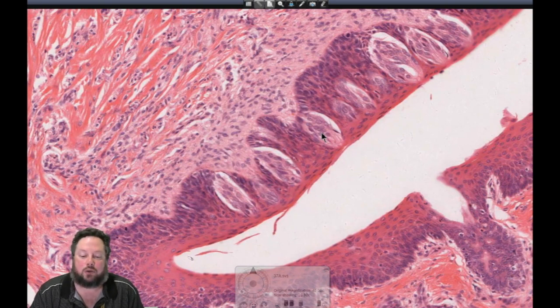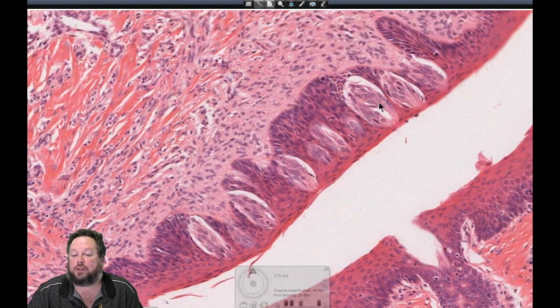Salty. One's tasting salty. And I think I mentioned in the lecture to the second year medical students, and for those of you who weren't there, there's a proposed 6th taste modality called oleogustus, which is a proposed taste of fat, but that's still being researched at the moment. So these are bipolar neurons.